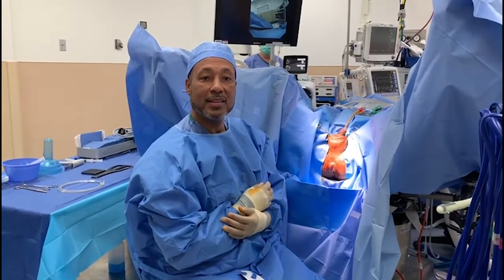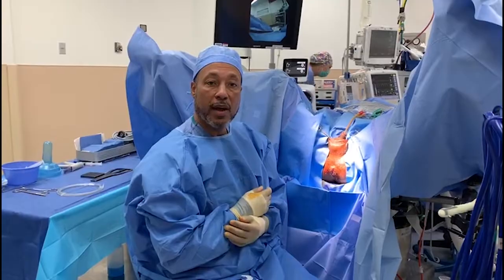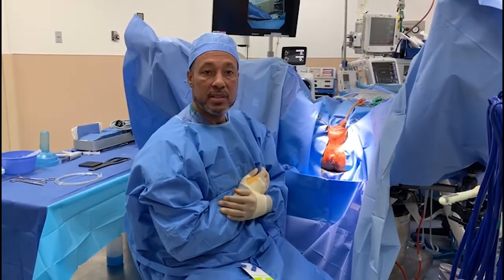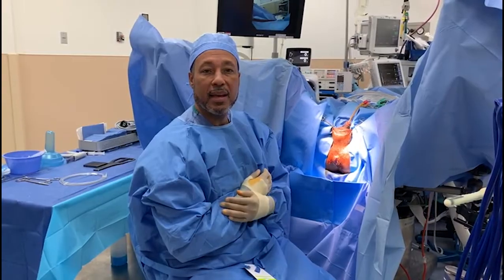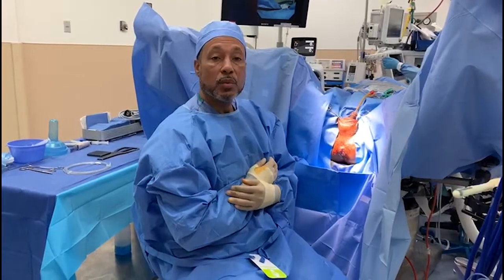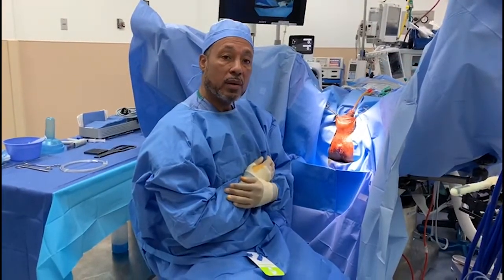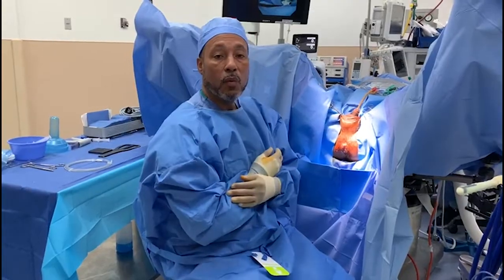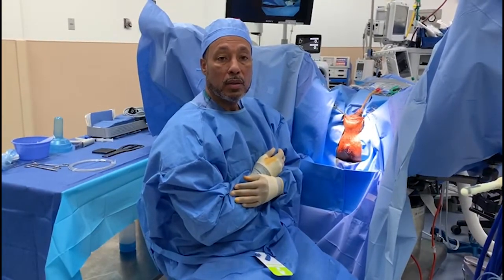Dr. Chris Halliwell from Z Urology. We're going to demonstrate a full cryo today. This gentleman has a localized low-risk disease with Gleason 6, PSA 7, and he desired curative therapy. We're going to demonstrate a full cryo of the prostate. He had bilateral disease, four cores total, two on each side.